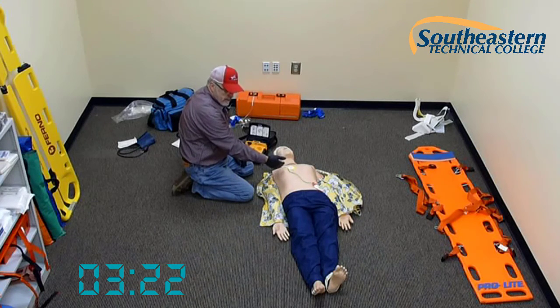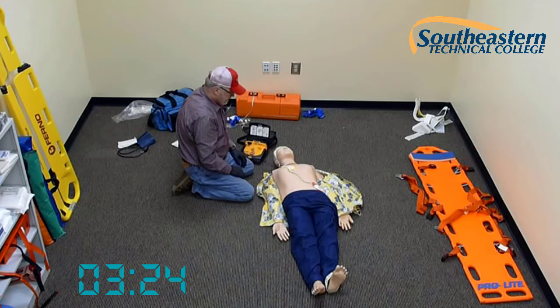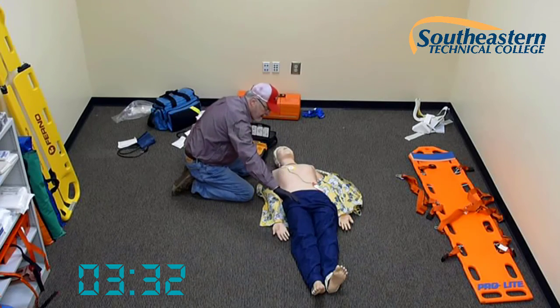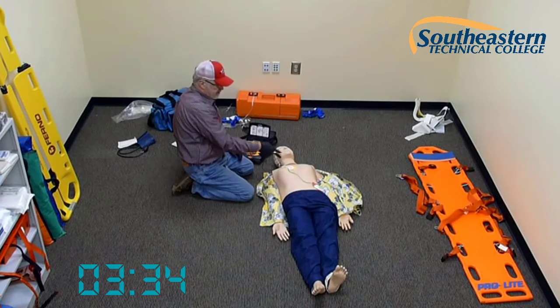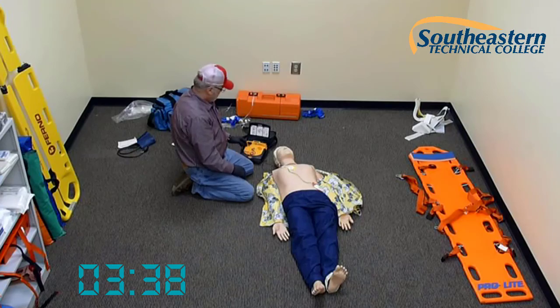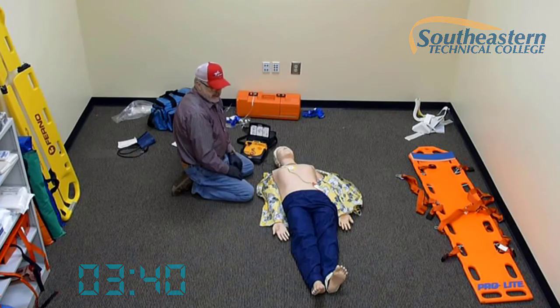We can actually be doing compressions while we're charging up. Clear. Press flashing button. Stop compressions. I'm clear, you're clear, everybody's clear, nobody's touching the patient. Deliver shock, immediately start back CPR. 1, 2, 3, 4. And rescue breath. And we'll be through with that scenario at that time.